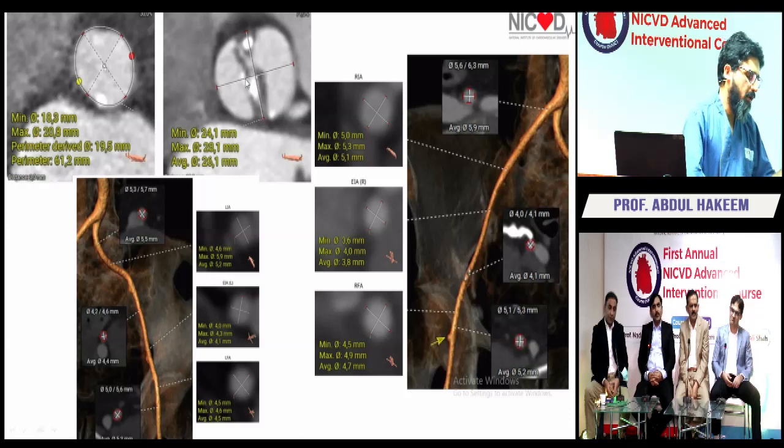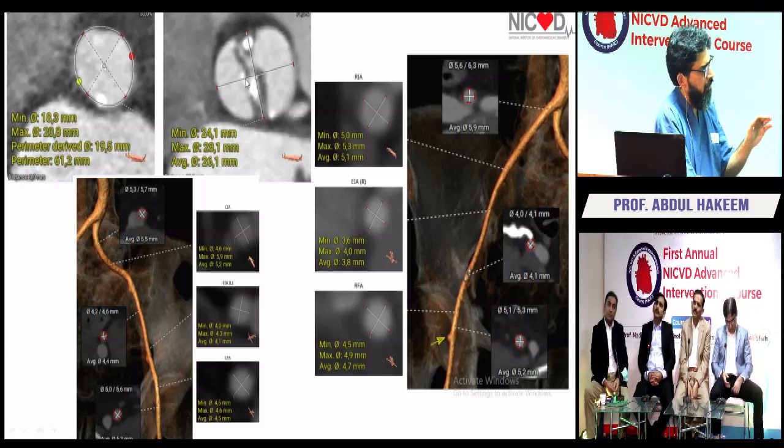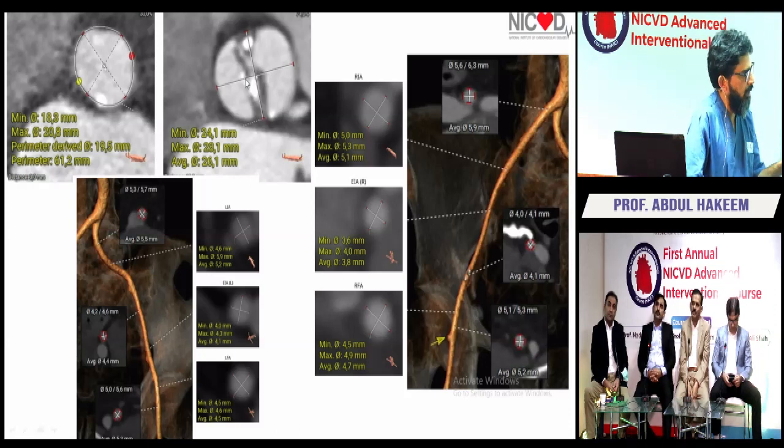Okay, so I disagree with the first part that you should always pre-balloon. In balloon expandable valves, we almost never pre-balloon. Because understand, in my first talk today, I told you that the risk of stroke is constant at 2 to 3%. In the best centers, the highest volume centers, it is 2 to 3%, which means that 3 out of every 100 patients will get a stroke. So the fewer the passes across the aortic valve, the lower the risk of stroke.